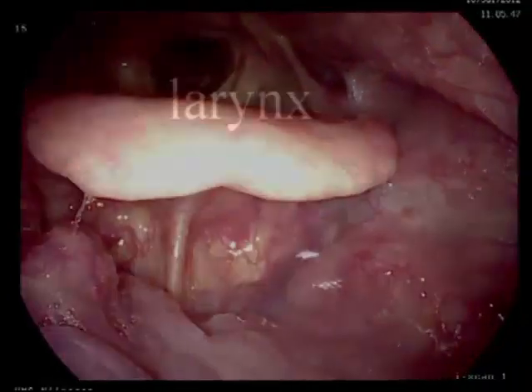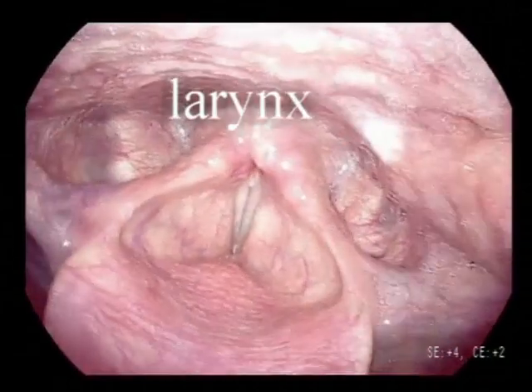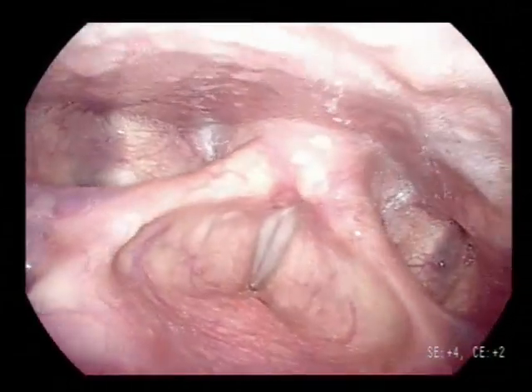When examining the larynx, try to avoid hitting any of the endolaryngeal structures, which will result in a gag reflex and sensitization of the larynx.